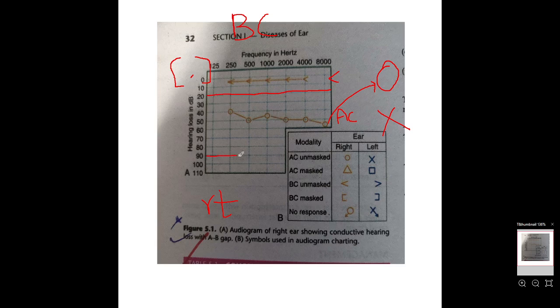The lower it is, meaning there is a problem with the air conduction and the person is hearing at very loud decibels. Okay, if the air conduction is at this level, meaning there is a problem with the air conduction of the person, and the person is hearing at 90 decibel.